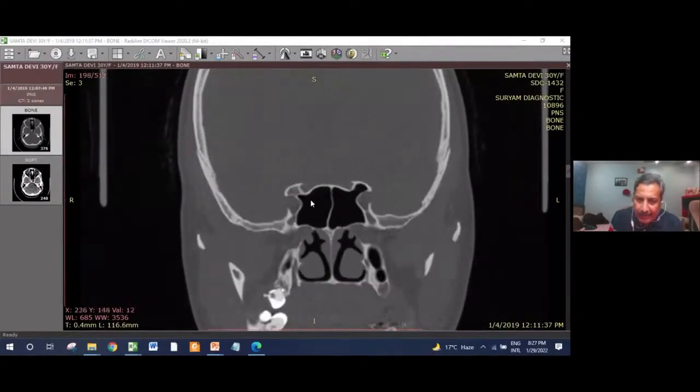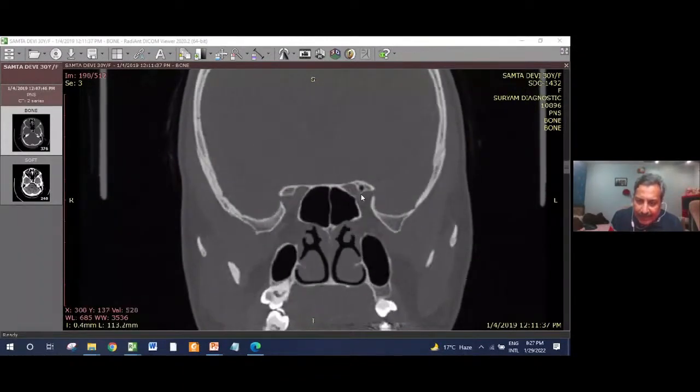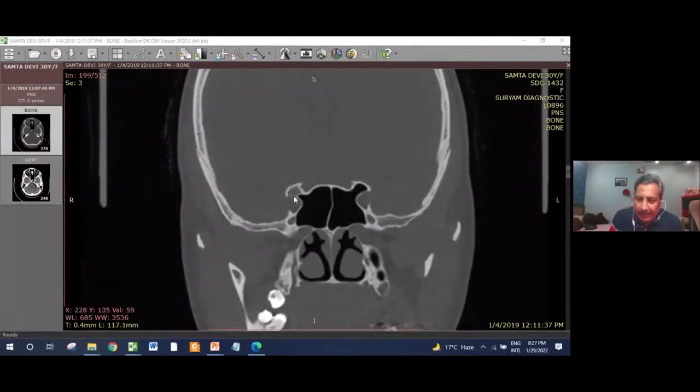So this is the optico-carotid recess, and here as I go behind, that's the impression of the carotid artery below. So above is the optic nerve, below is the carotid artery, and see this pneumatization is known as the optico-carotid recess, the lateral optico-carotid recess. Endoscopically, you need to mark all those areas, the medial OCR and lateral OCR, to mark your anatomy perfectly. And this is very important to understand what you can make out with a CT scan here.